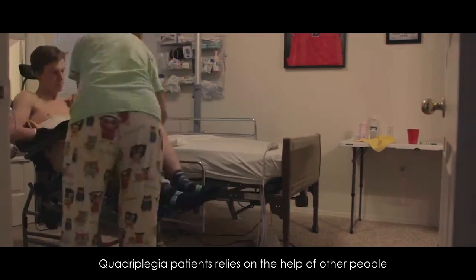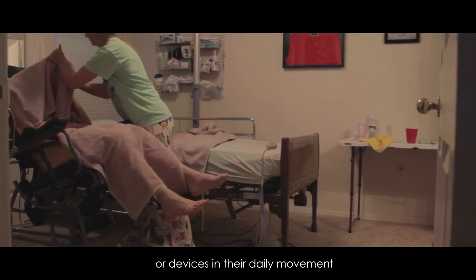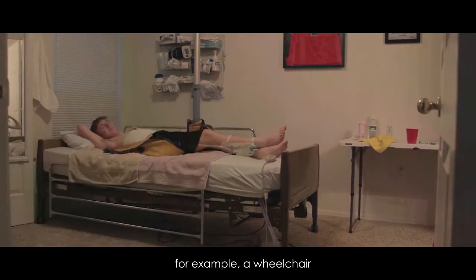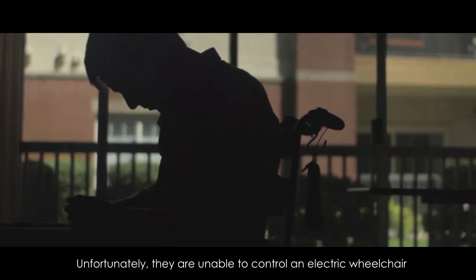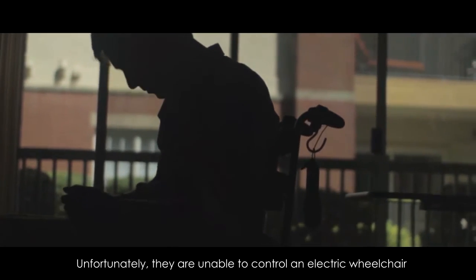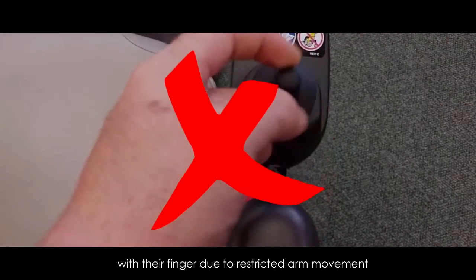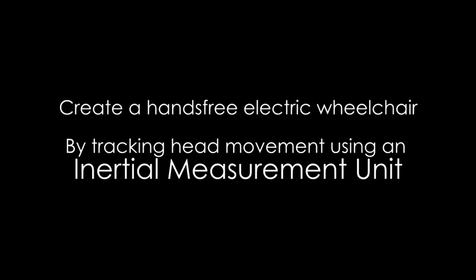Quadriplegia patients rely on the help of other people or devices in their daily movement, for example, a wheelchair. Unfortunately, they are unable to control an electric wheelchair with their fingers due to their restricted arm movement.